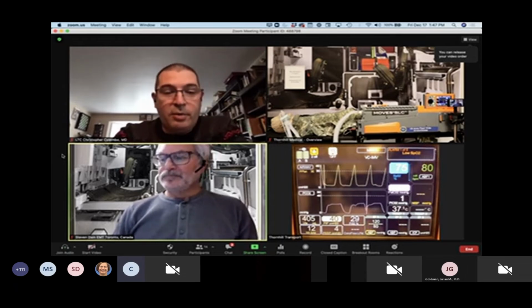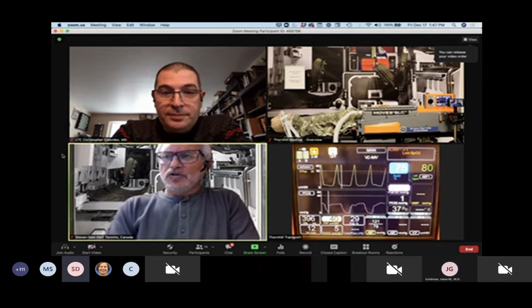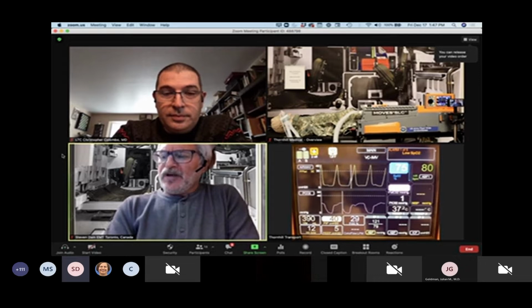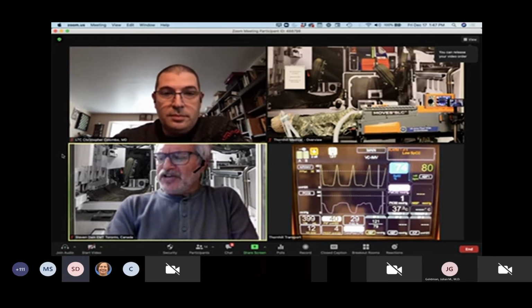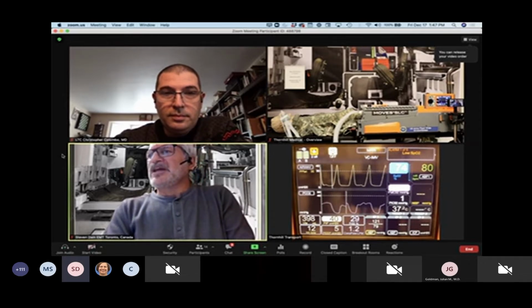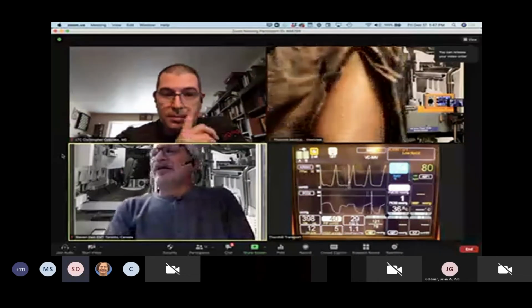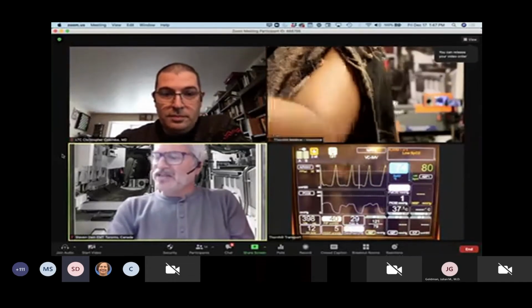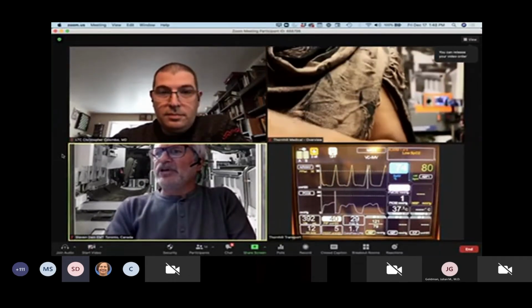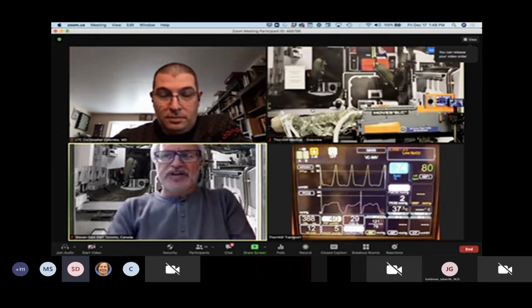Dr. Dane, this is Dr. Colombo, critical care Netson. How can I help you? I have a 70-year-old woman here on a Thornhill Medical MOVES SLC integrated life support system that also has an oxygen concentrator built into it. The patient's blood oxygen level has dropped to 77%, and I need some help. I'm not familiar with this device. It's now 74%. Wondering if you could give us a hand in responding to the situation.